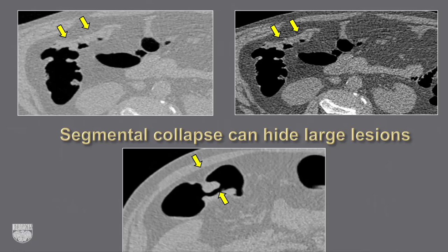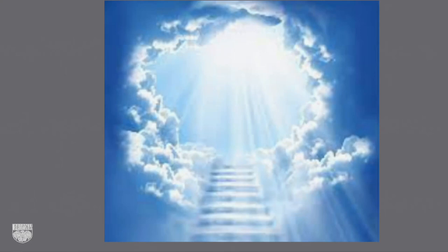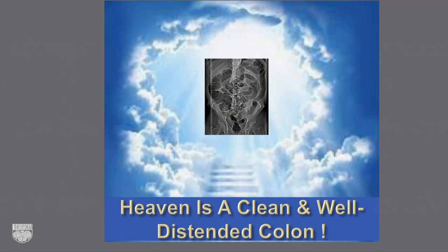When you have a collapsed area, if you have a center line and can fly through, the case may still be readable. But a collapsed segment can hide a large lesion — here a circumferential mass is completely hidden, and changing window settings doesn't help. You may need to qualify: if it's the recto-sigmoid or sigmoid, maybe a flexible sigmoidoscope could evaluate it. Otherwise, you'll need colonoscopy or a repeat exam. In virtual colonoscopy, heaven is a clean and well-distended colon.